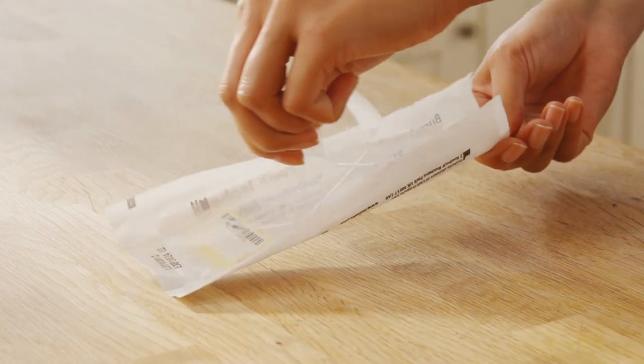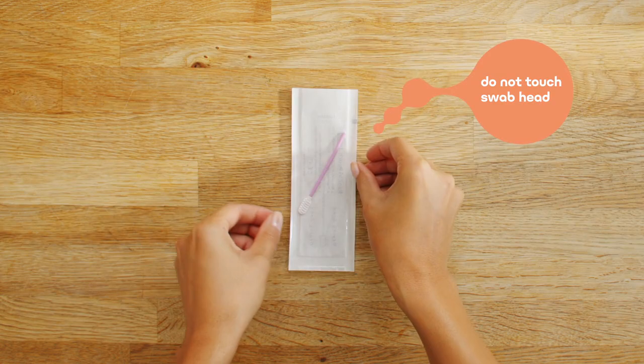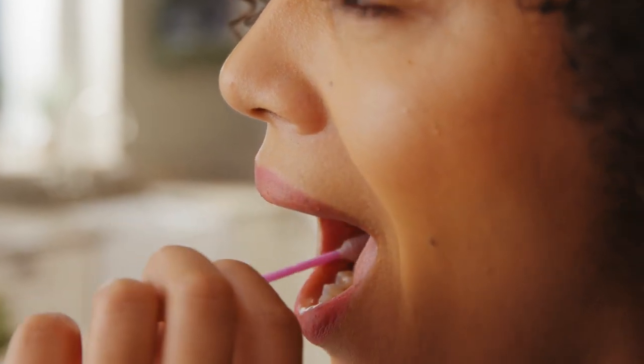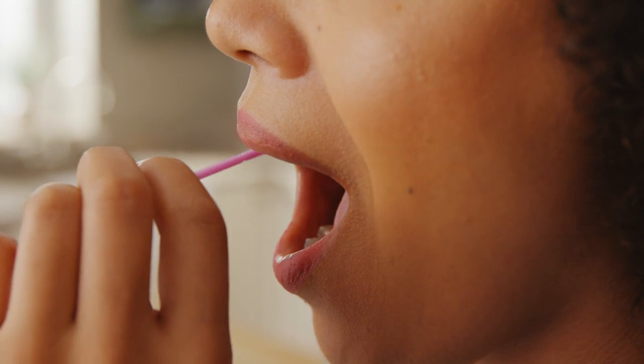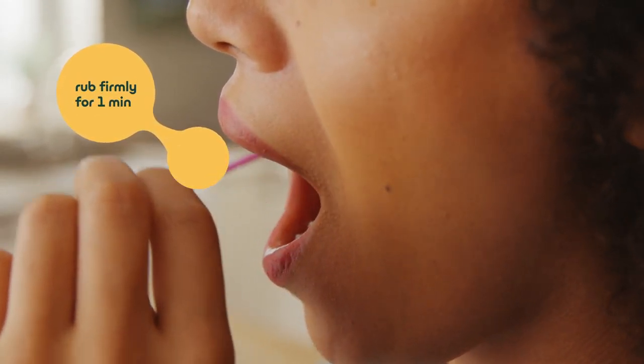Peel open the pouch and remove the swab, taking care not to touch the white swab head with your fingers. Insert the swab into your mouth and rub it firmly against the inside of your cheek or underneath your lower or upper lips. Rub firmly for at least one minute.